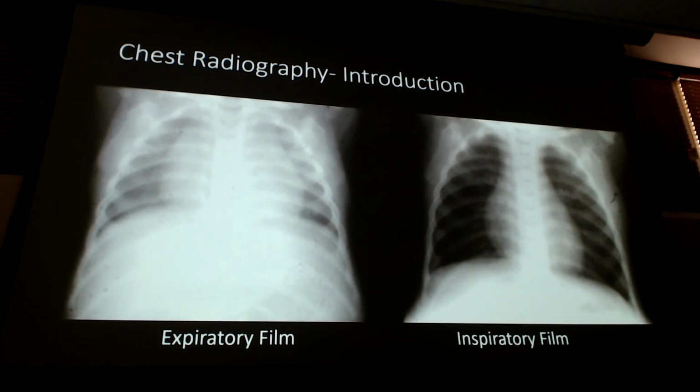There's what it looks like in pediatrics. It does the same concept. Right? I know the images are crappy. This is just meant to show inspiration and expiration. Other than that, I can't diagnose anything off of this.